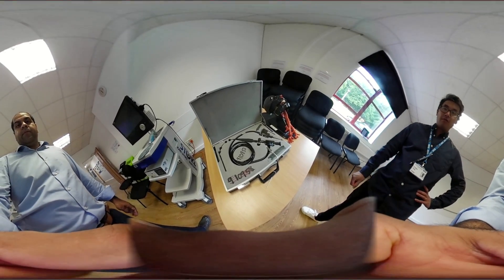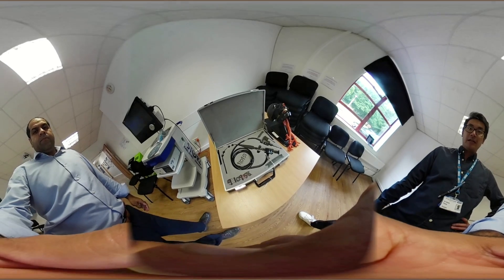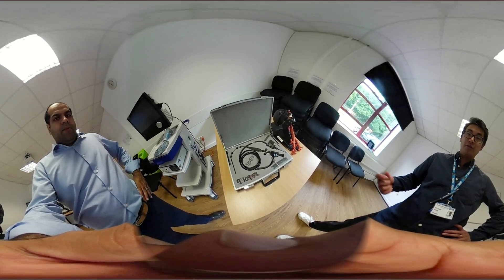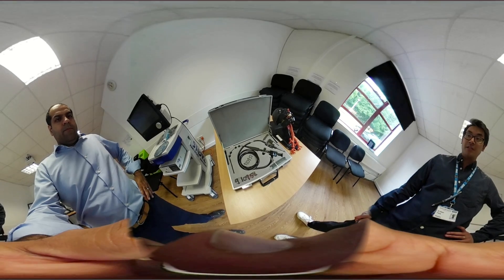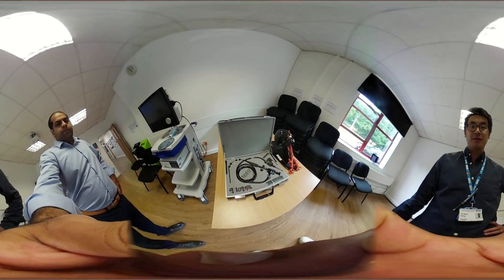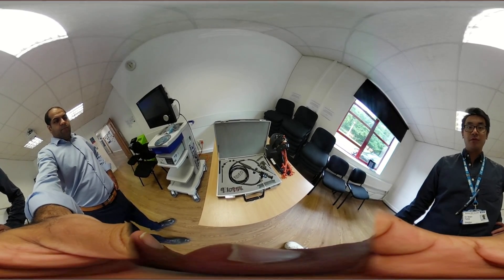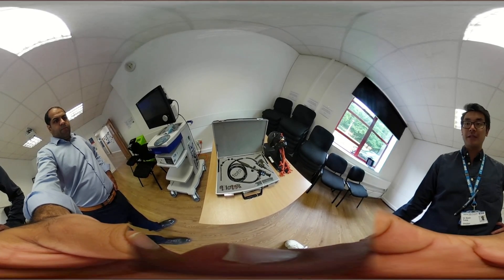This is a video introducing flexible nasal endoscopy. It's one of the most commonly performed ENT procedures, and essentially all new ENT SAHOs will become confident and competent at doing it, because we use this procedure in the majority of patients we see both acutely and electively in clinics. It's something worthwhile for the majority of diagnosis of any presentation to ENT, especially on an urgent basis.